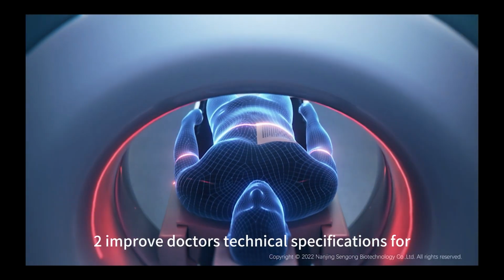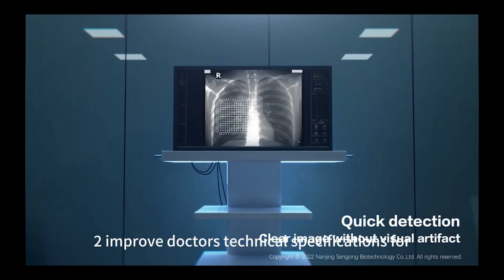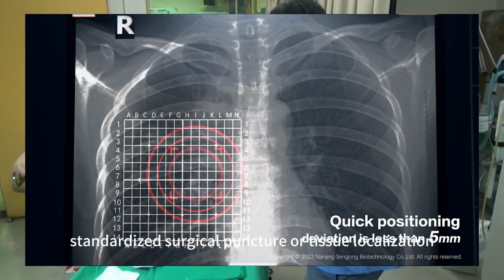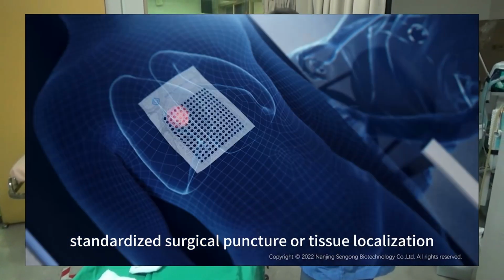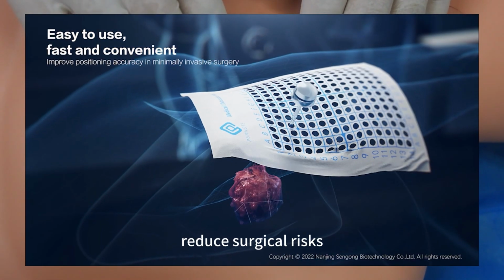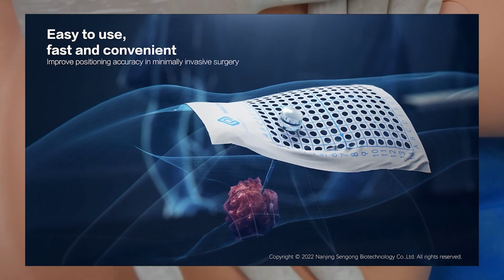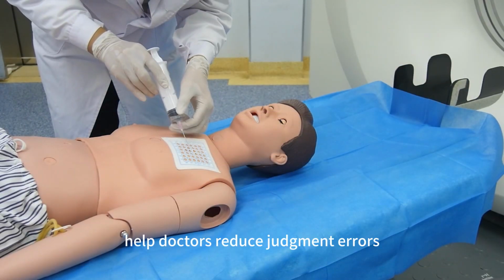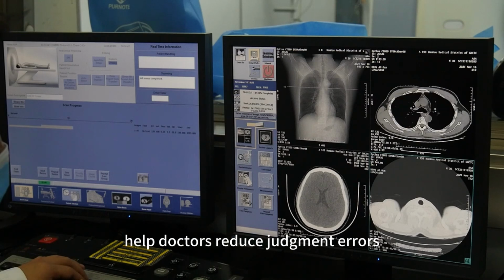2. Improve doctors' technical specifications for standardized surgical procedures. Standardize surgical puncture or tissue localization. Reduce surgical risks. Also beneficial for improving doctors' skills. Help doctors reduce judgment errors.